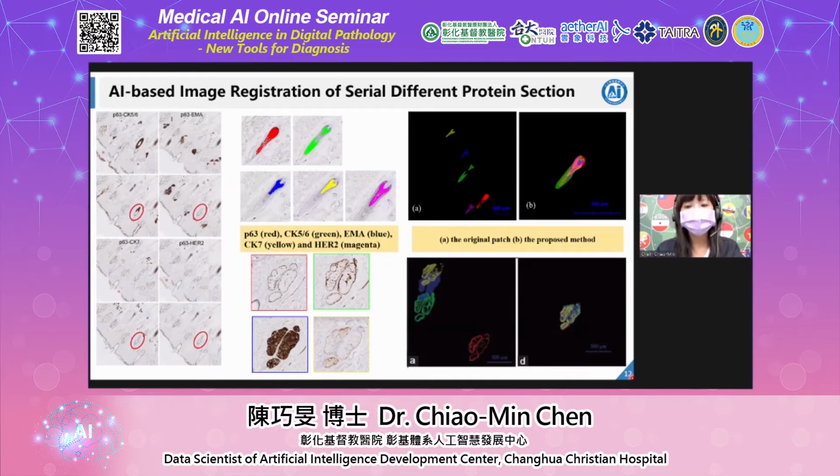However, these methods are usually expensive, labor-intensive, and highly technique-demanding, making them unlikely to be screening tools. Hence, these results display this. The proposed method provides a feasible and robust image registration method for serial section slices. Advanced screening studies of proteome topology and further cell-level reconstruction of diseased tissue.